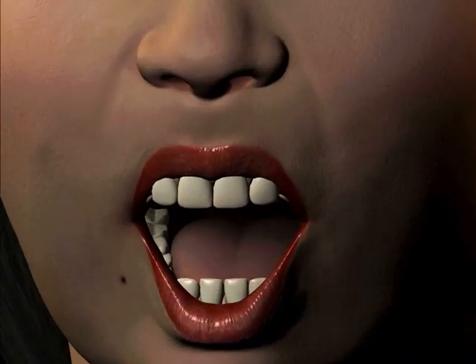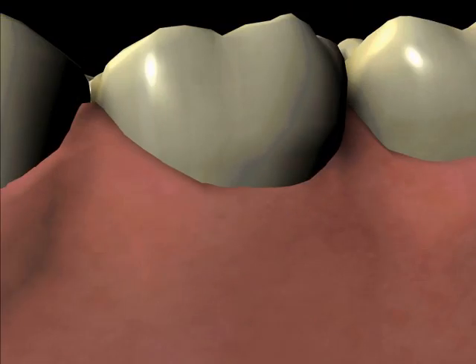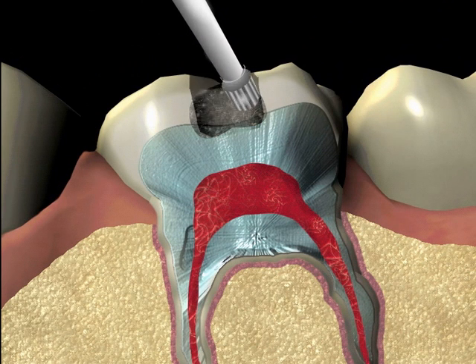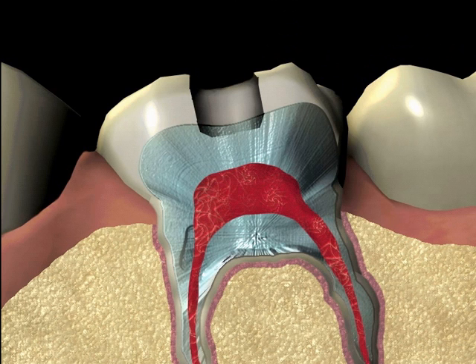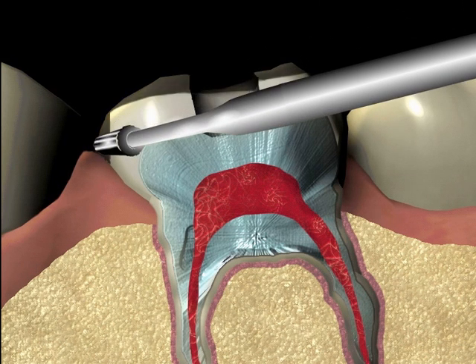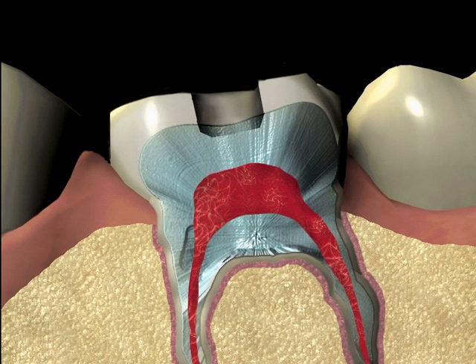Two steps, one appointment for each step, are needed to place a crown. The first step involves the removal of any decay and filling material in the tooth and the removal of any weakened tooth structure. The remaining tooth structure is then examined and some reduction to the outside of the tooth may be needed to get a proper fit and shape to the crown restoration.